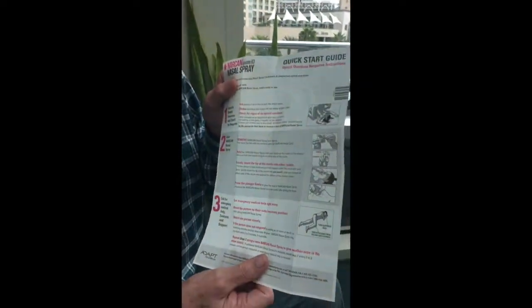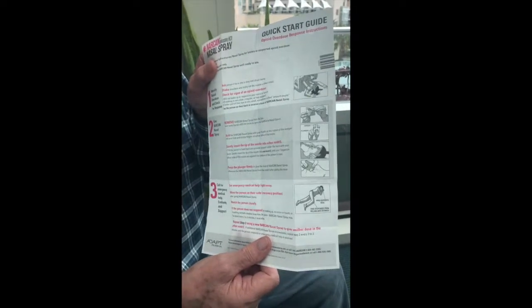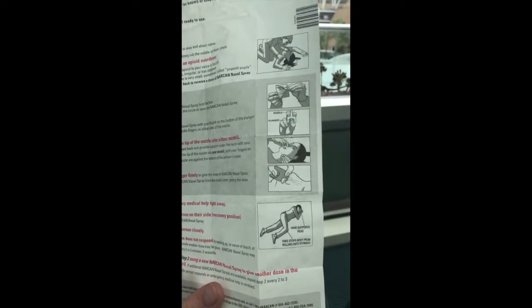Inside each Narcan spray is an instruction sheet that tells how to use it. It basically says you put the patient down if there are signs of opioid overdose and squirt it in the nose. They should be supine when you do this, though it would probably work if they're sitting up if you can't get them down on their back. The pictures on how to use it should be relatively straightforward.